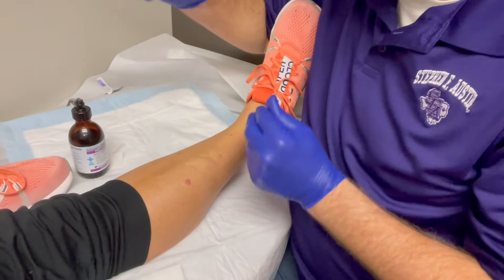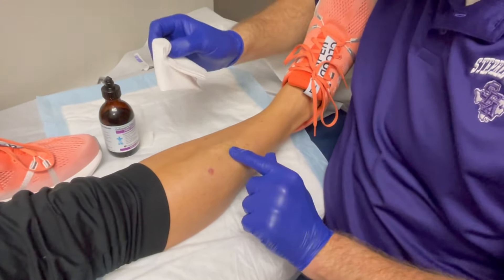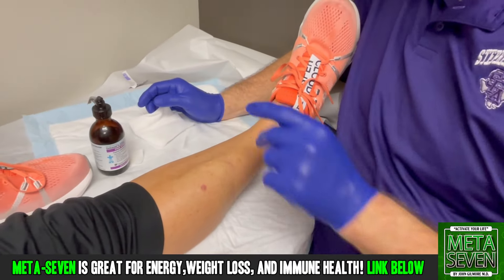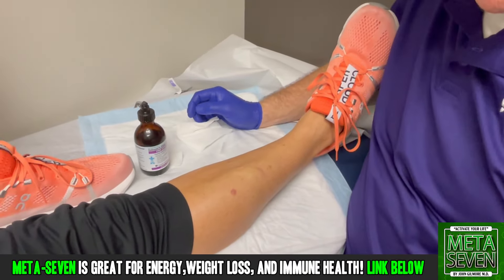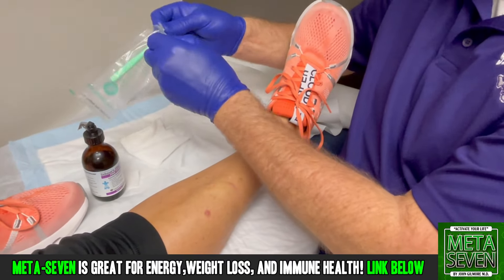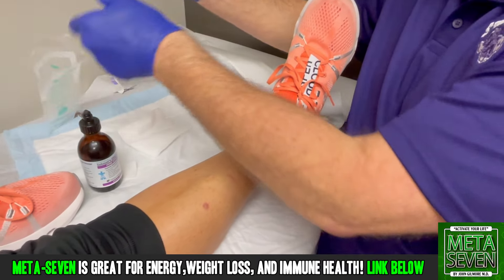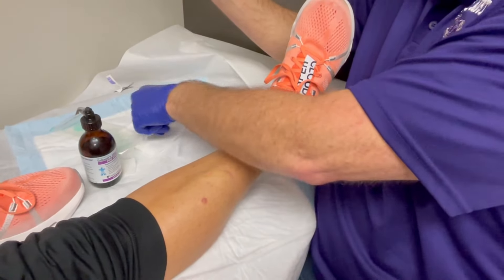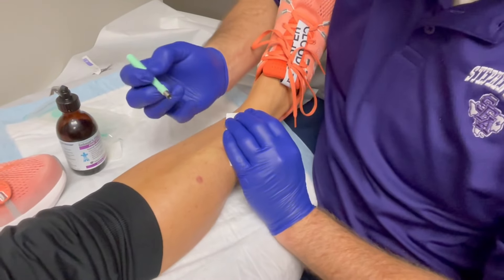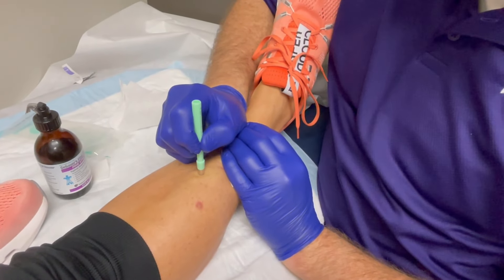Okay, there we are. How was that? Not that bad. You're gonna let me get the punch biopsy? Yes sir. I'll go ahead and open it myself — if I open it in advance and it's the wrong one... it's a six millimeter punch. Do you feel any pain? No sir. Good.